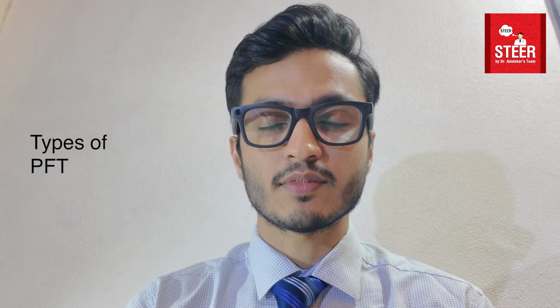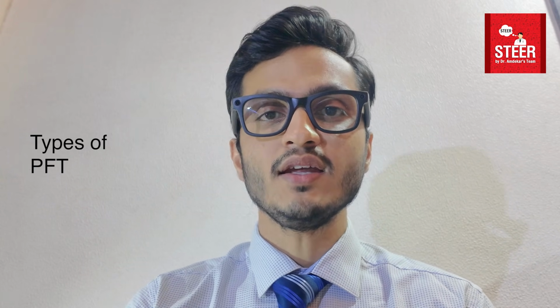So first, let us understand a few basic types of pulmonary function tests, commonly being peak flowmetry, spirometry, impulse oscillometry, fractional exhaled nitric oxide. Other less commonly done pulmonary function tests include gas dilution tests, multiple breath washout tests, or even tests like body plethysmography. So let's understand these common tests one by one.